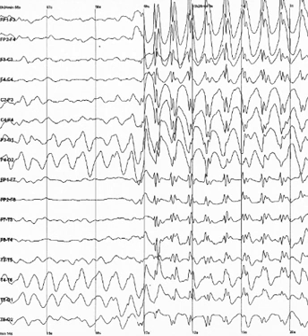Since an EEG voltage signal represents a difference between the voltages at two electrodes, the display of the EEG for the reading encephalographer may be set up in one of several ways. The representation of the EEG channels is referred to as a montage.